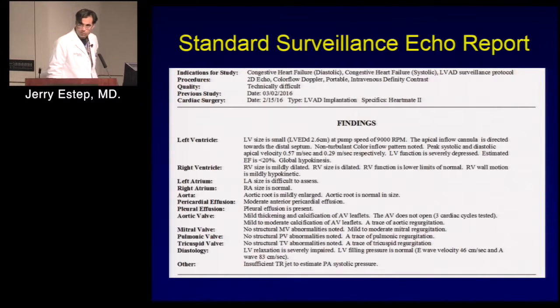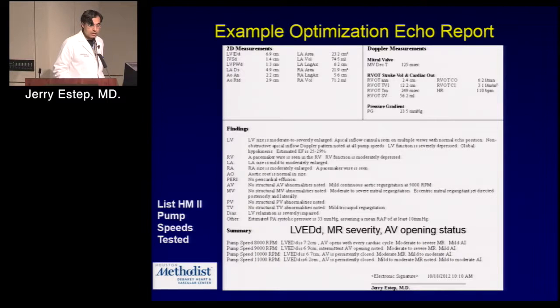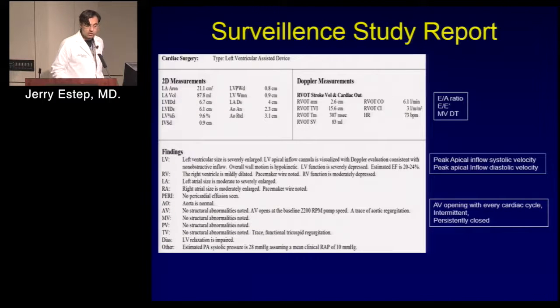So my goal, and I say it every year, and I think this year I have to do it, is to put these in the echo lab: here's the surveillance echo report, here's the rule out pump malfunction report, here's the pump speed optimization report, here's a myocardial recovery report. And so really what we're looking for is apical inflow, systolic and diastolic, aortic valve opening status, interventricular and interatrial septal position, in addition to the standards of the read. That would be just a surveillance study.